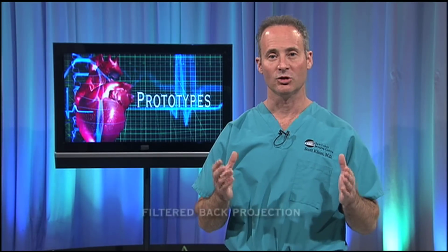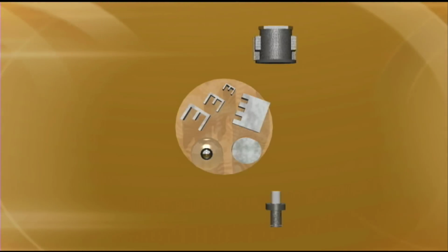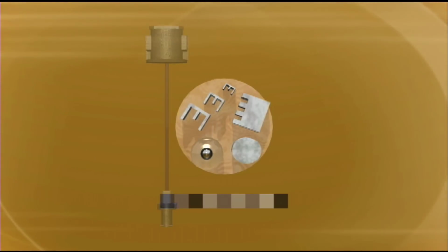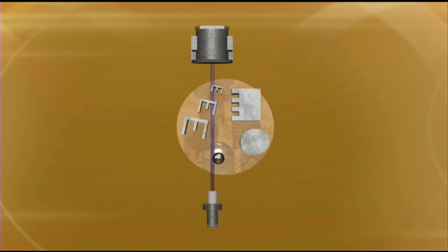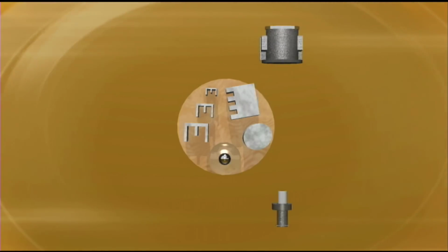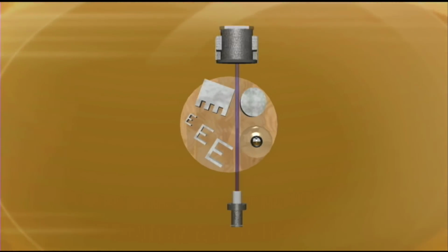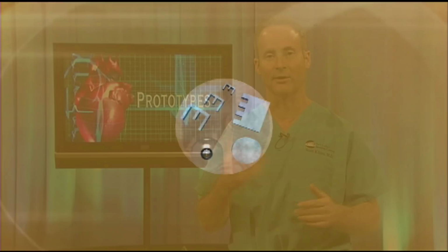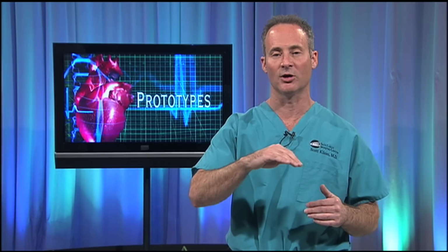Basically, what you would do is you would have images that were created after each pass. You'd get a series of grayscale images. If you took those grayscale images and passed them back through the imaging plane using a computer, you could actually reconstruct that image. The more images you pass through, the more clear picture you got of the original scanned object until you made it all the way around to 180 degrees.